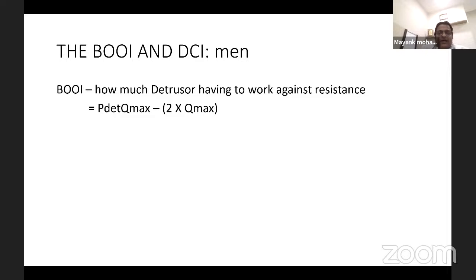Now, you know that a patient's weight in relation to his height is the criteria for calling obesity, isn't it? You cannot call a 6 feet 5, 80 kg man obese, right? So same thing goes for these things. Only pressure cannot tell you. Extremes are okay, but a routine pressure cannot tell you whether it's high or not high. You have to corroborate it with the flow.